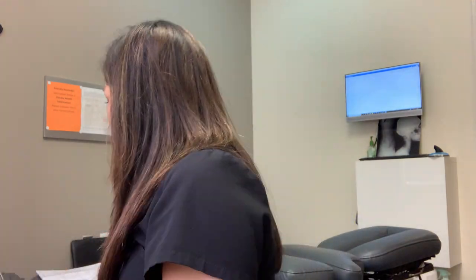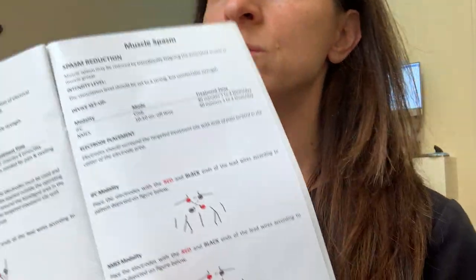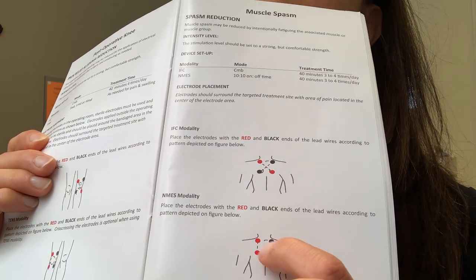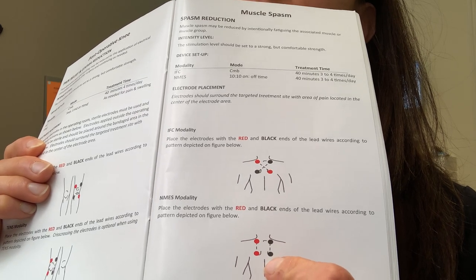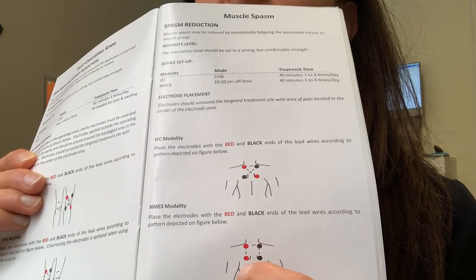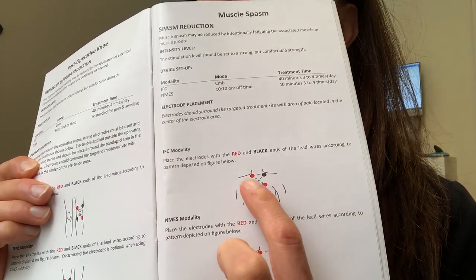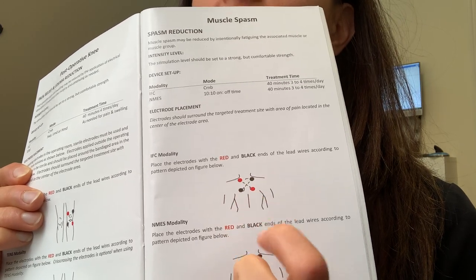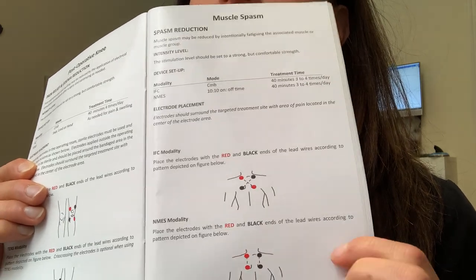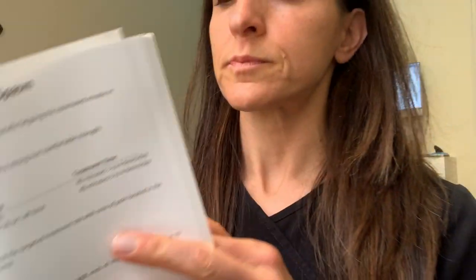Take a look at your booklet — I am on page 31. If you can read the backwards display, it shows the NMES modality and how to set the pads up. This would be for an upper back placement. Notice there are two red leads and two black leads. For IFC setting, they actually cross the leads across the spine or the area. This is page 31, and that shows you how to set it up for upper back.